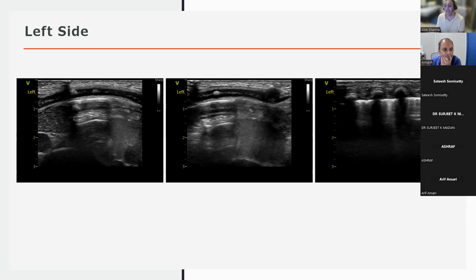And if I see better aeration in that area, that whiteout B profile has become an AB profile or a double lung point, I know clinically the baby's getting better. That's how I'd clinically correlate. I wouldn't necessarily put the baby prone just to get better images to satisfy that 30-minute rule. Does that answer the question?